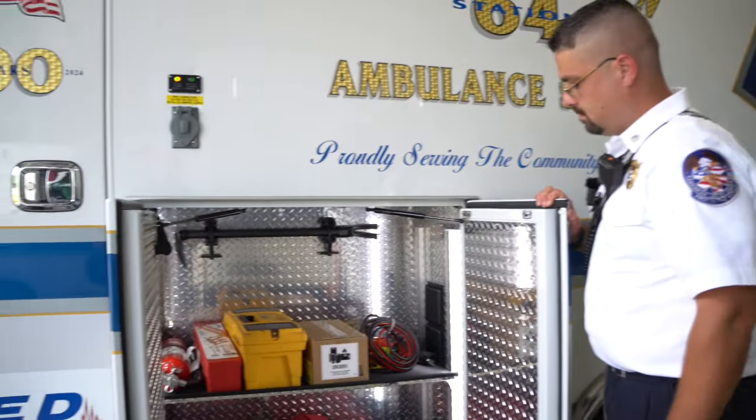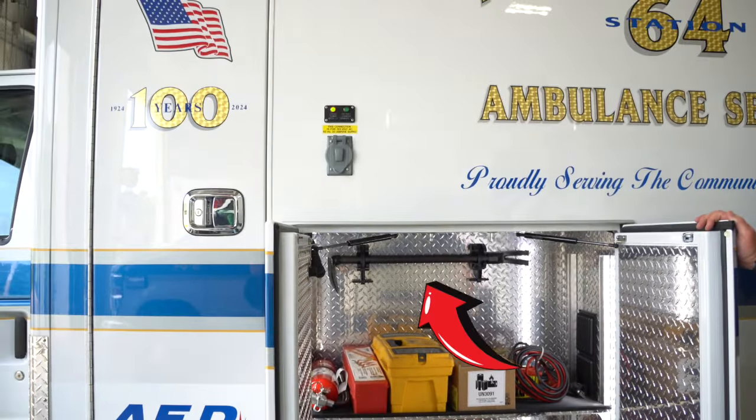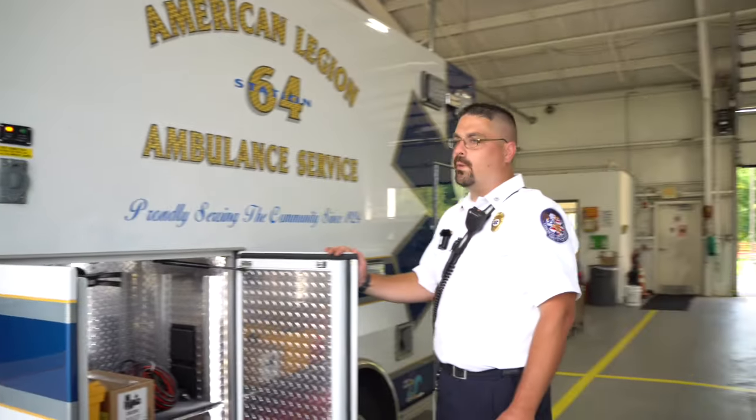I noticed you have an old-school backboard for CPR and some fire tools — you have a Halligan in there. Why would an EMS service need a Halligan? Not all the time is the fire department on scene with us. If we need to gain entry into a residence — if somebody dials 911 and is unable to unlock the door — we can make forcible entry using these tools to gain access.